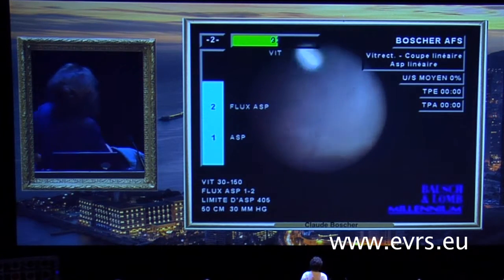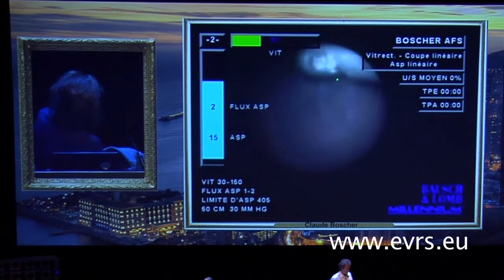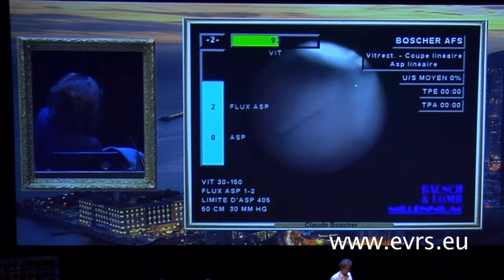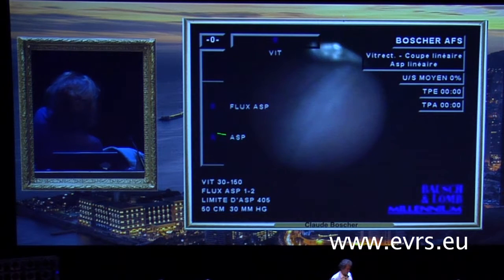So I had to keep, for the first part of my talk, the movies done with my old machine, which was not the EVA machine. It was the previous Bausch & Lomb machine, which was a flow control machine. But it is very easy to understand how it works, because the vitreous has a tremendous variation, and especially when you are aspirating a mixture of BSS and vitreous gel, as you are dissecting here at the root of the posterior attachment of the anterior vitreous base. So you see that the flow is at 2 cc's because I decided it would be at 2 cc's. And you see the vacuum which spontaneously moves in order to provide me with a constant flow of 2 cc.